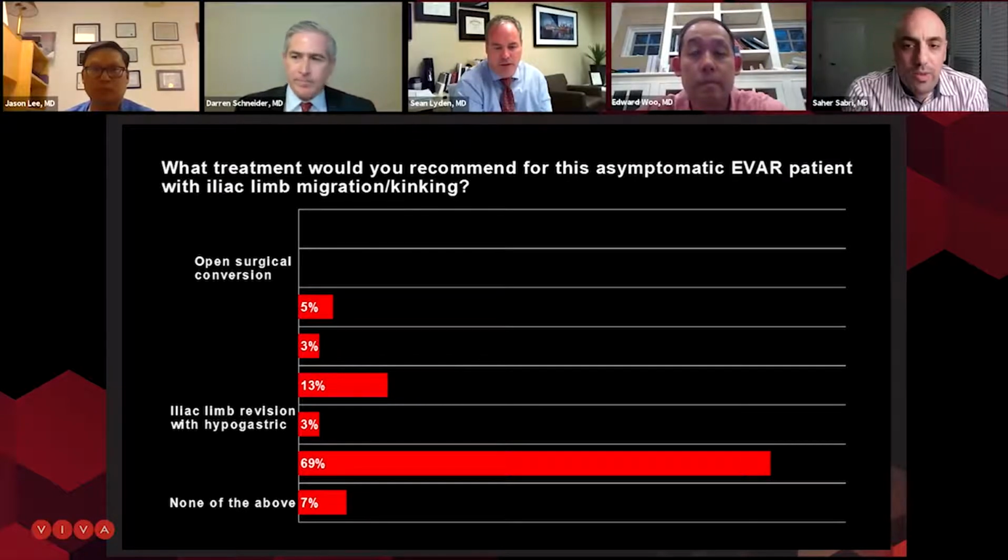And I think the other big value now. Yes, sir. Is there much value now for these large flared limbs? There's 28. I mean, is there a good time to use them with the iliac branch device now? I feel like they're bound to fail unless somebody's much older and won't tolerate a long procedure.